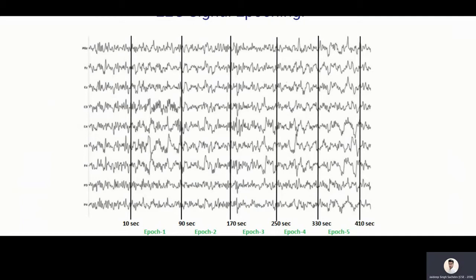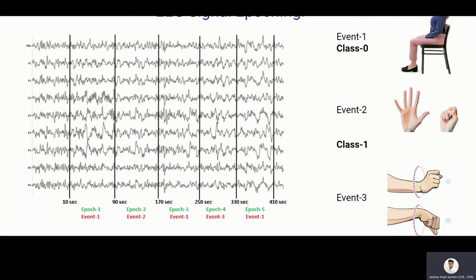And then from 90 to 170 seconds, event 2 happened. So what we are doing is we are extracting this 10 to 90 second part and similarly 90 to 170 second part. And we get some small chunks of signals. So when we divide it, you can see these are different events.